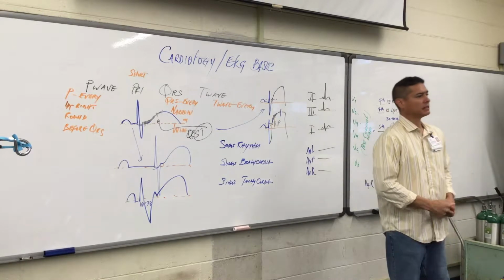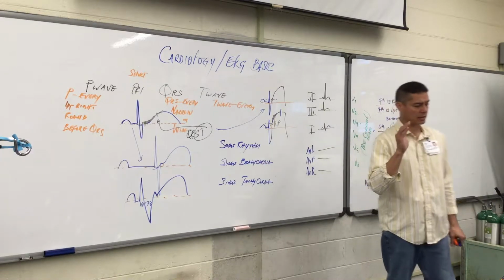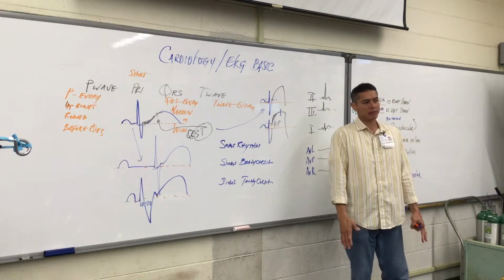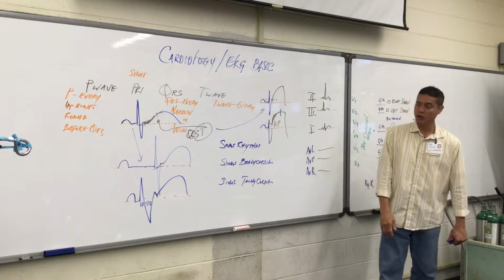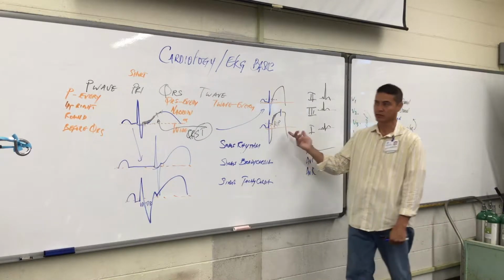Luckily for us at the basic level, when we're putting it on our 12-lead EKG, a lot of this will have some interpretation. So it's important that when you press for analyzing and acquiring your 12-lead EKG, all the leads are on, the patient is in the stillest position they can be, and you put in the age and sex, and make sure it's of diagnostic quality for it to interpret this rhythm.